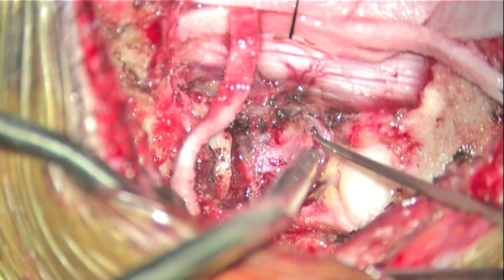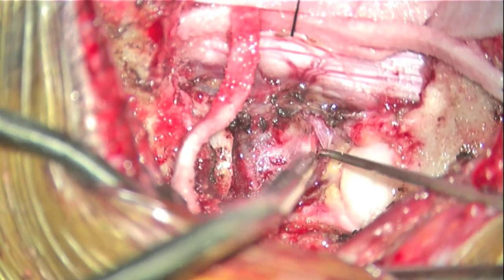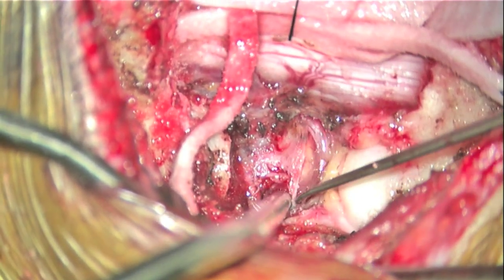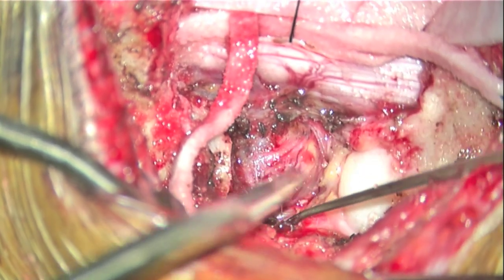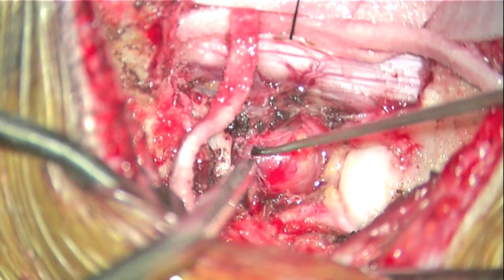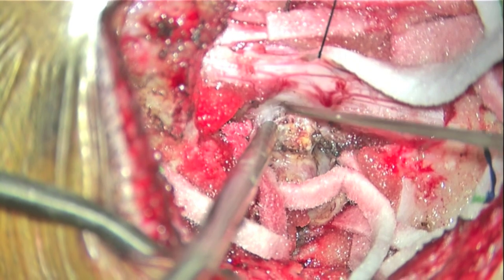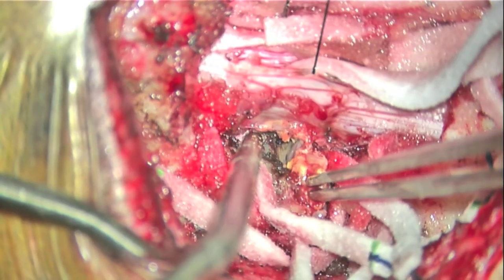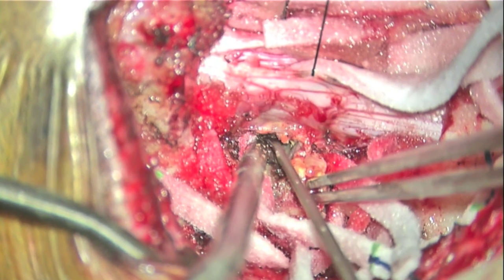This is particularly important ventrally, where the tumor will often be in contact with the vertebral artery and paravertebral venous plexus. Here, I'm dissecting through foraminal veins to get to the true tumor capsule. Here we begin mobilization of the medial tumor margin. This is carefully performed under direct visualization with both blunt and sharp dissection techniques.